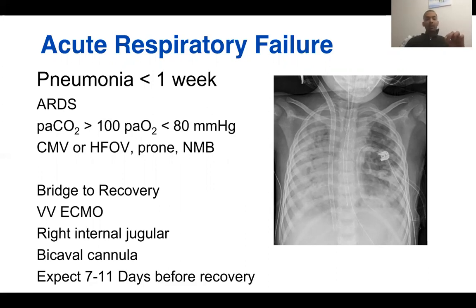And then there is another port that is exactly aimed in the right atrium, okay, where the cannula passes through the right atrium, and that will force blood as a jet into the right atrium through the tricuspid valve area into the right ventricle.